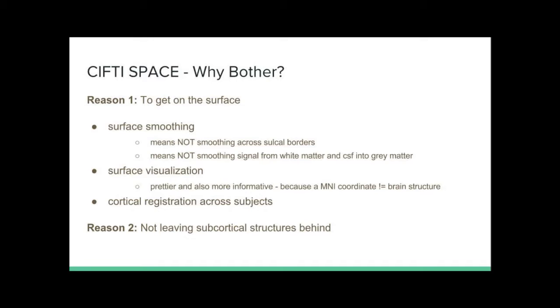The other thing it does is it does this without leaving data from the subcortex behind. A lot of other packages that have been put forward for working on cortical data basically throw out the subcortical data from your pipeline analysis steps, and it's really hard to reintegrate subcortical data into your analysis afterwards.